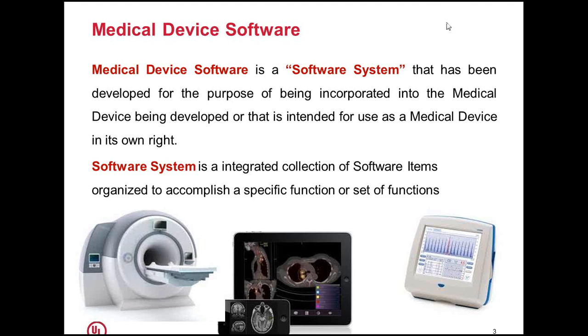Medical device software: what is a medical device software? It's a software system that has been developed for the purpose of being incorporated into the medical device, or that is intended for use as a medical device in its own right.